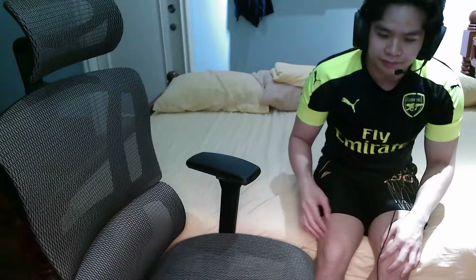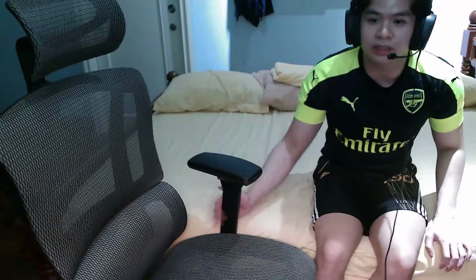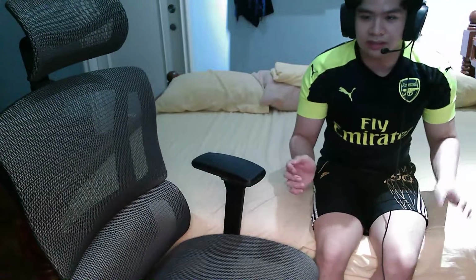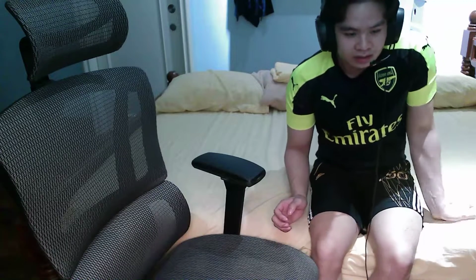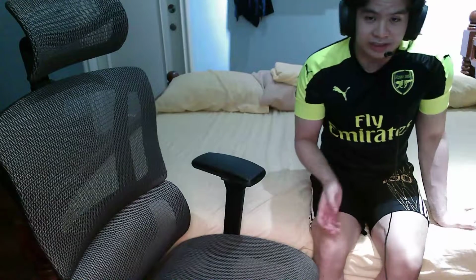And then what I want you to do is, with one hand, make sure by the way that your wheelchair brakes are on lock, sir. So make sure you lock that first. So with one hand on the bed, really try to do this again. Have your arm, have your shoulder, have your hands facing outward as much as possible, like this. Obviously, you can't do this because it's quite hard. So you can keep it like this, sir, and then one arm on your wheelchair like this.